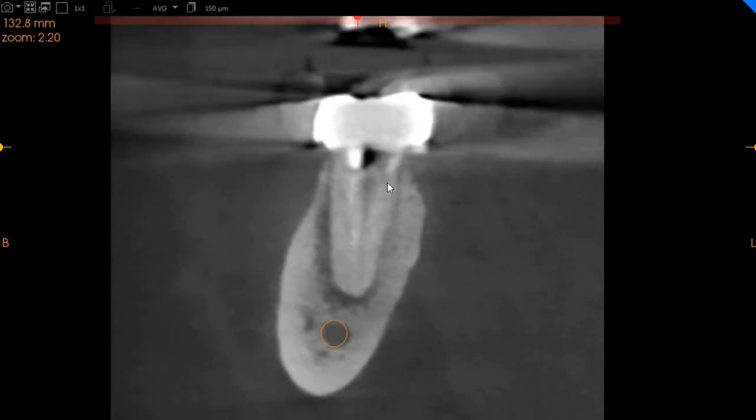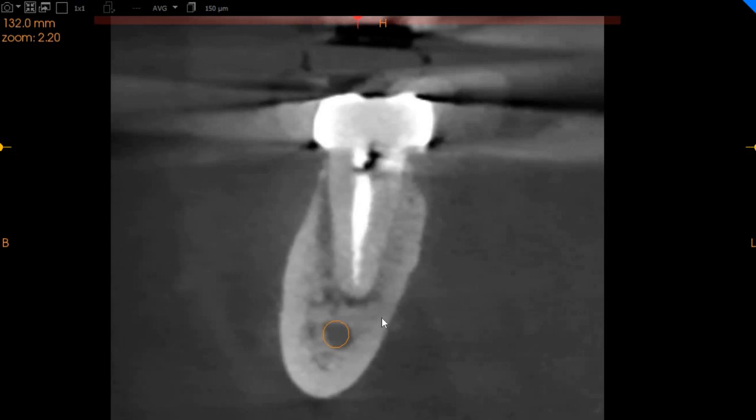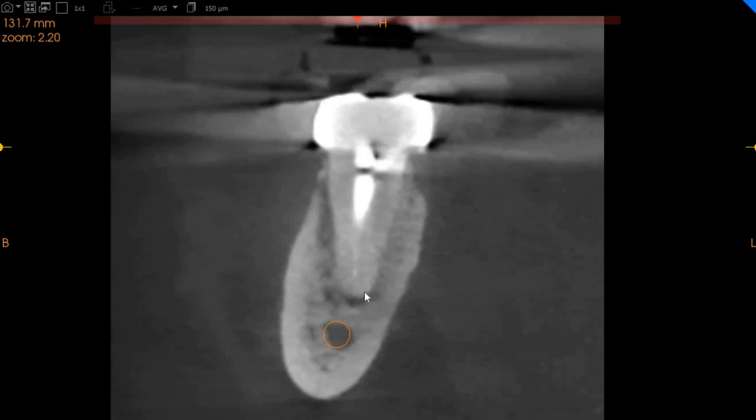Moving to the distal aspect of this tooth, the distal root contains one canal and that one canal has been obturated completely. We do feel like there is a periapical radiolucency but not very significant. However, we do see that there is PDL thickening on the buccal aspect of this tooth, which can be seen right here.